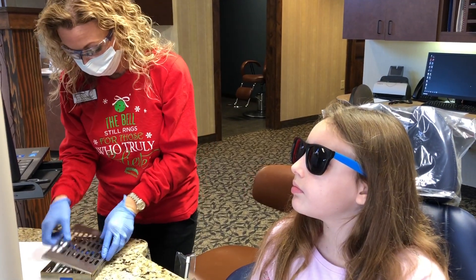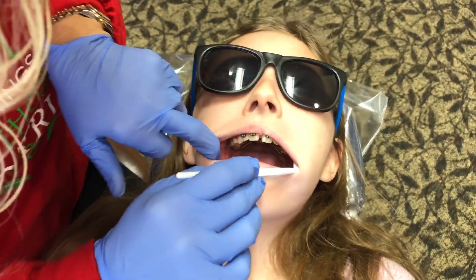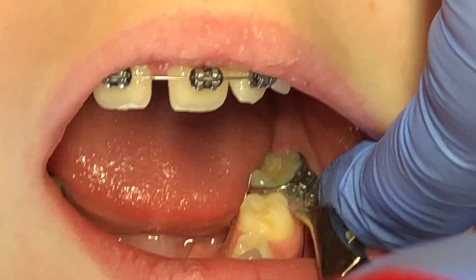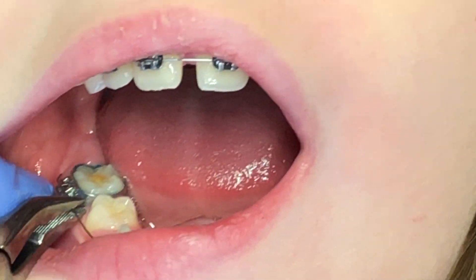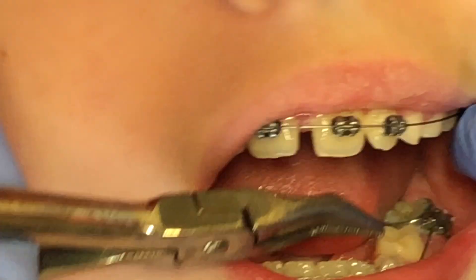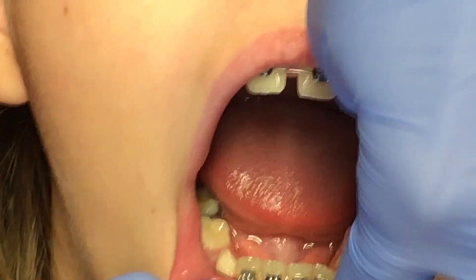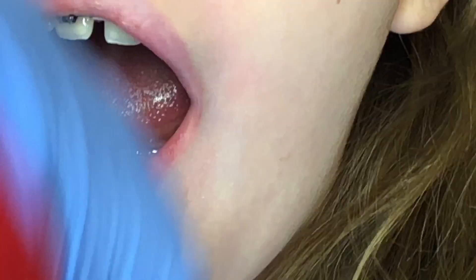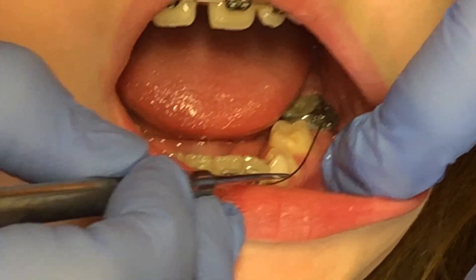What's bothering you? A wire. We tried to work it in there — we didn't know it was broken. It was hard to tell, it's just a little mangled. No worries. All right, open real big. So mom, if this wire gets pushed, see that? You can pull it out again.